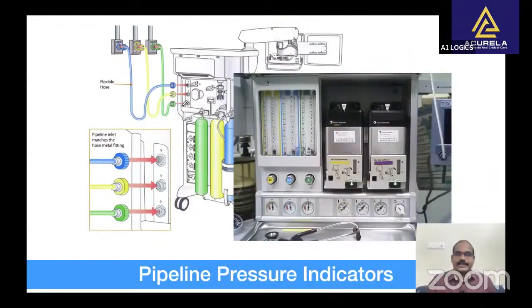If for any reason the gas pressure coming from a cylinder via a pressure regulator exceeds the pipeline pressure and a cylinder valve is open, gas will be drawn from the cylinder. Therefore, cylinder valves should always remain closed when the pipeline supply is in use.